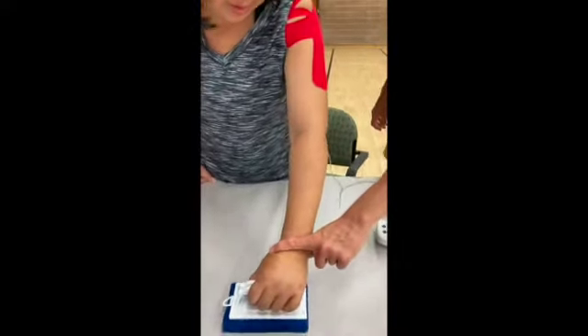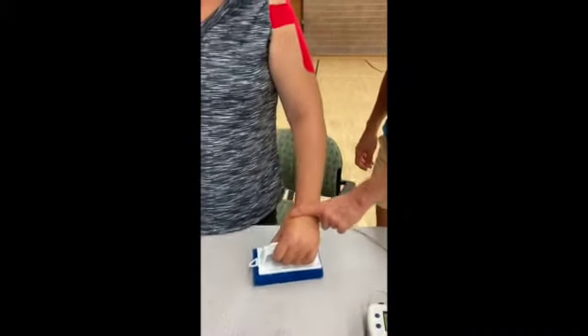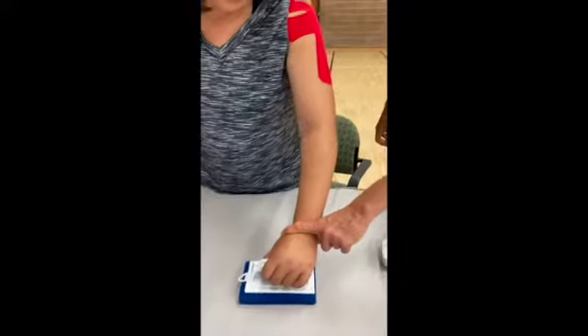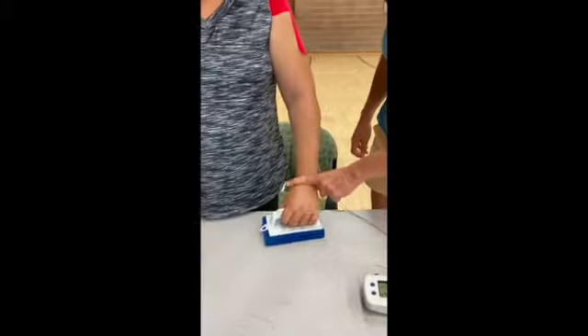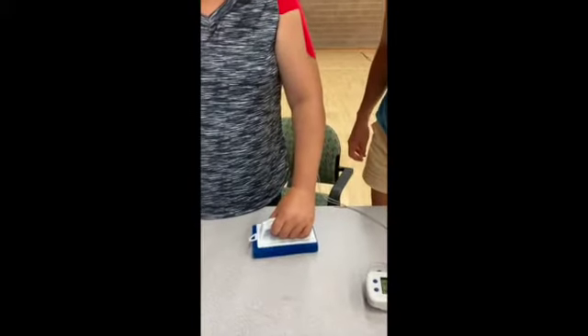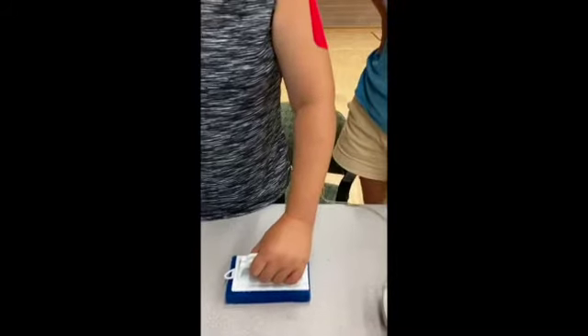This video shows this motion while the person engages in weight bearing on her affected hand using the sponge. Weight bearing helps with reducing spasticity in tight muscles of the affected arm while also promoting muscle contraction stimulation in weak muscles. This can also be done using a towel roll or washcloth.